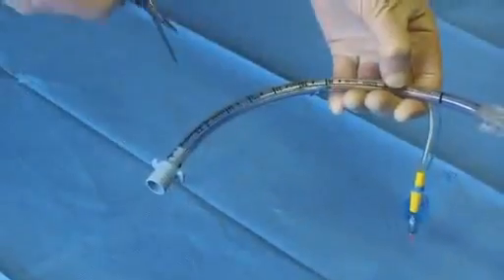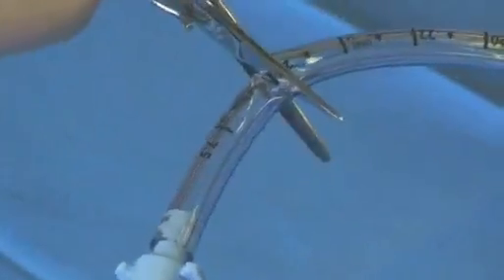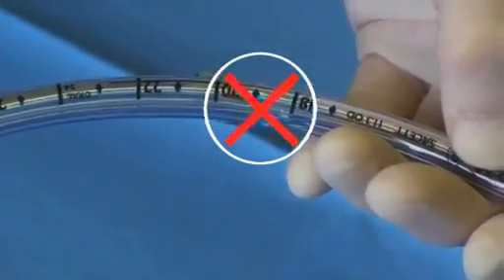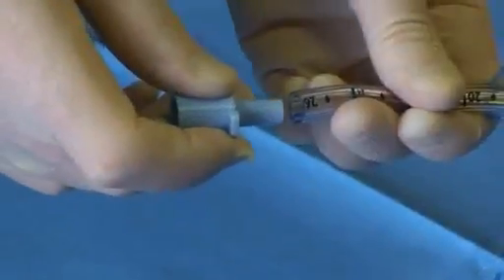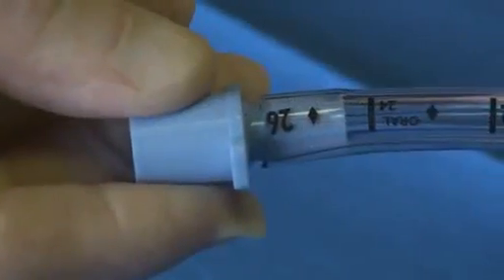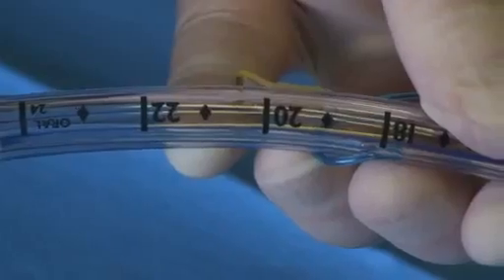Once the length of the tube has been determined, cut the tube to the length desired. When cutting the tube to length, do not cut close to the joint between the inflation suction line and the main body of the tracheal tube, as blockage or leakage of the inflation suction system may occur. Firmly insert the 15mm connector provided into the tracheal tube. Do not use lubricants to assist with the insertion of the connector, as disconnection may occur.